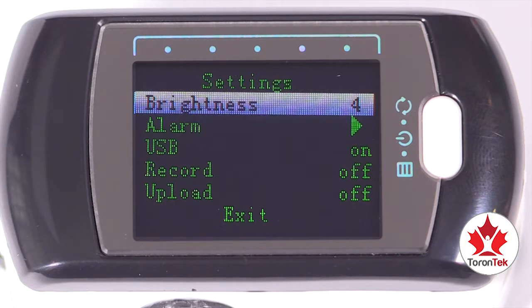The available settings are: brightness, alarm, USB, record, upload, and exit.